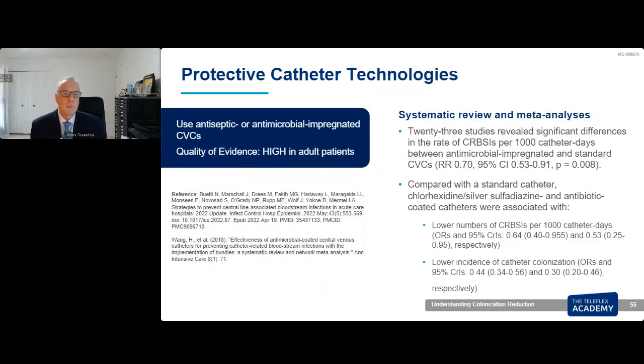What happened about protective catheter technologies? As I mentioned before, Bueti, Mermel, and other people published the guidelines of APIC, SHEA, IDSA with the support of CDC and Joint Commission in May 2022. They, as I said, recommended essential practices, additional practices, not recommended to do, and unsolved. These protective technologies are part of the additional recommendations.